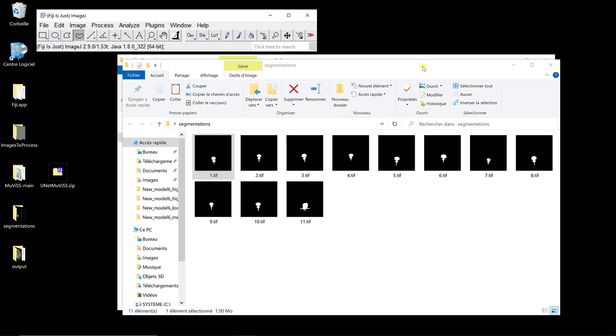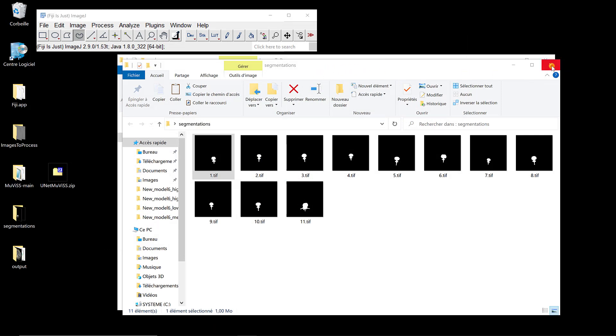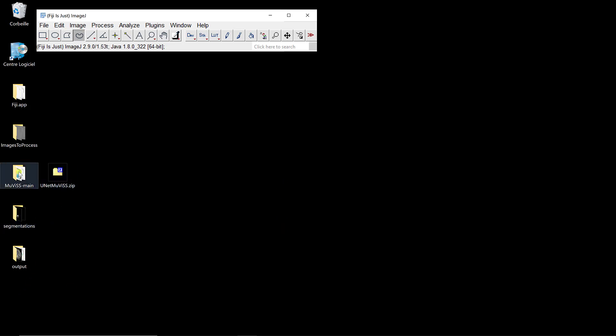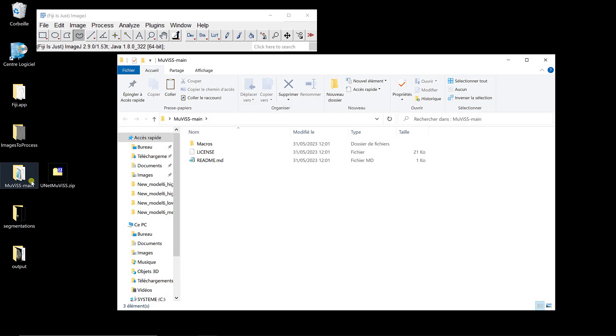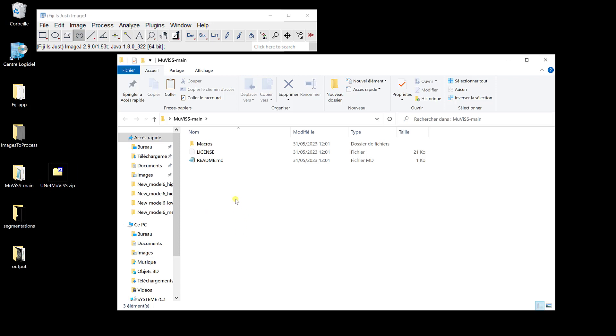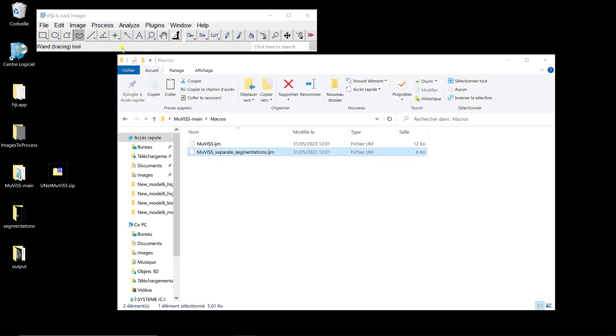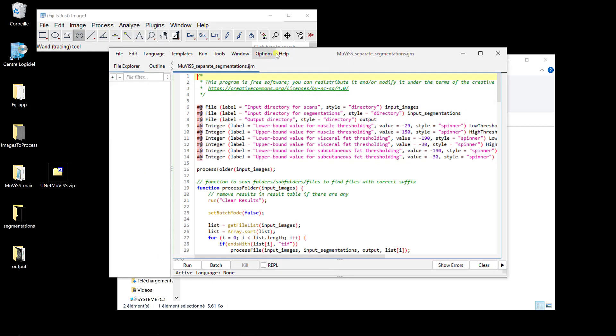Here I want to use the second macro to do the computations of the different areas within a range of intensity when I already have segmentation. So I'm going to go back to the GitHub folder that I downloaded from the muvis page. And here in macros you have one which is called muvis separate segmentations. So it means that you already have a segmentation.